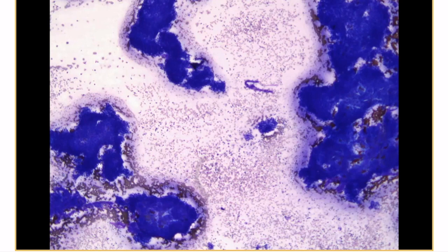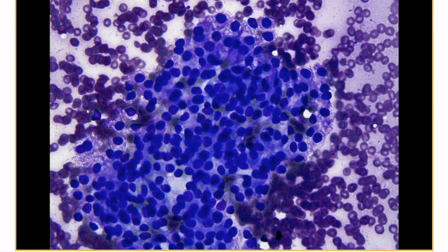On a low-power view, you have a very cellular sample with three-dimensional, syncytial groups of cells. On a closer look, you see the cells have abundant oncocytic cytoplasm, some vessels, lots of naked nuclei in the background, but they are mostly very uniform, very monomorphic. A closer look here, you see the cells have a bit more vacuolated, or coarsely vacuolated, somewhat also granular cytoplasm, but again the cells are very uniform.